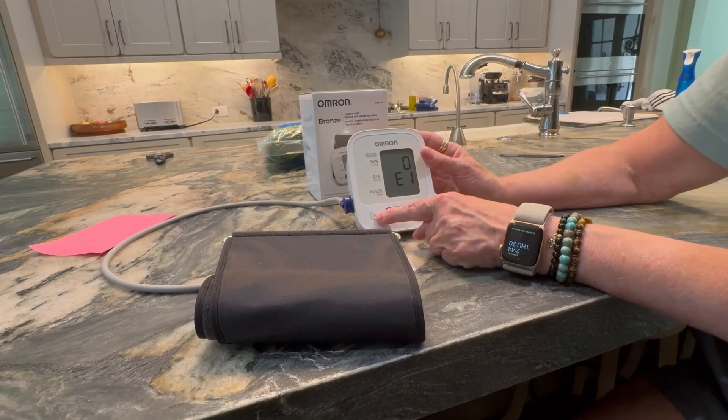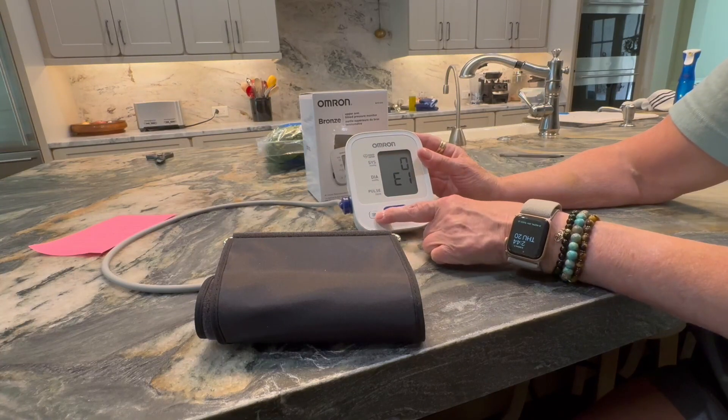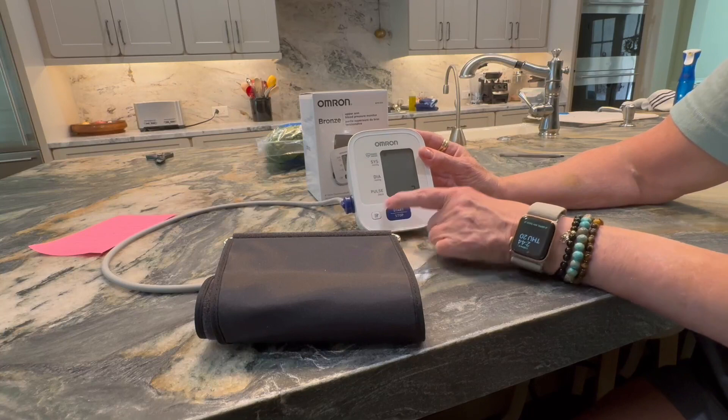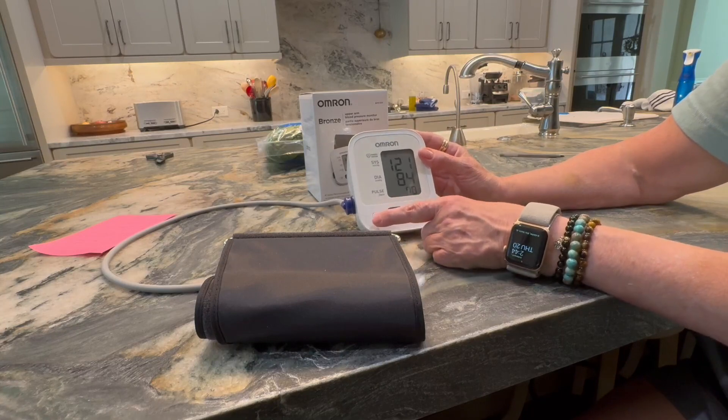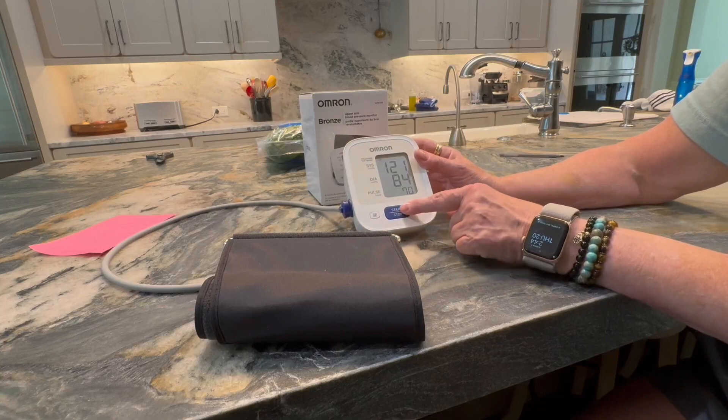It also stores 14 different readings for one person in the box itself. You just push this little button right here and it will tell you what the reading was. That's my last reading, and then you turn it on and off right here.